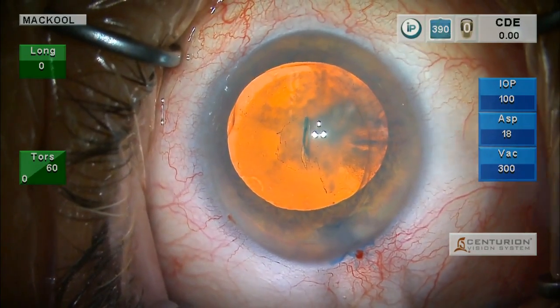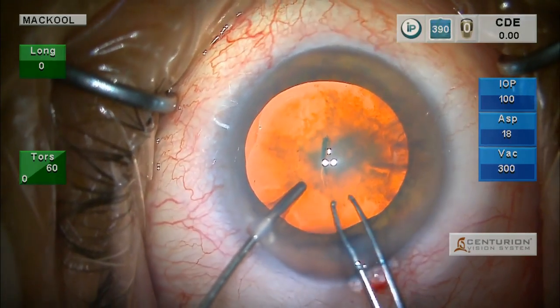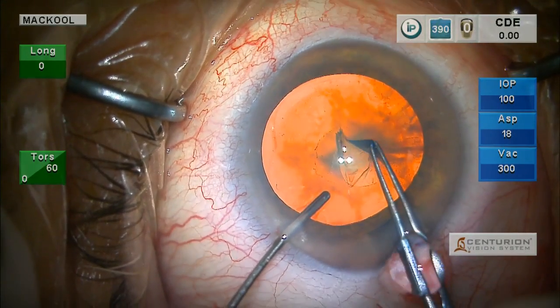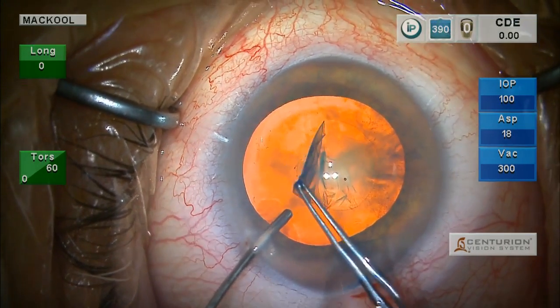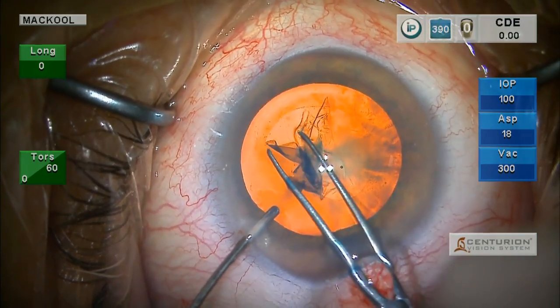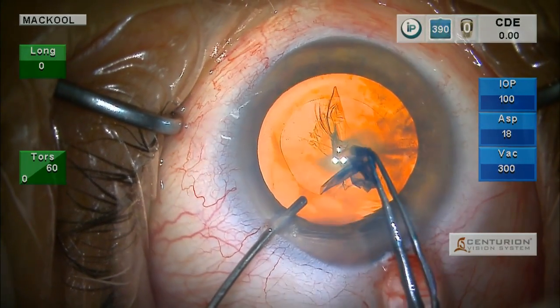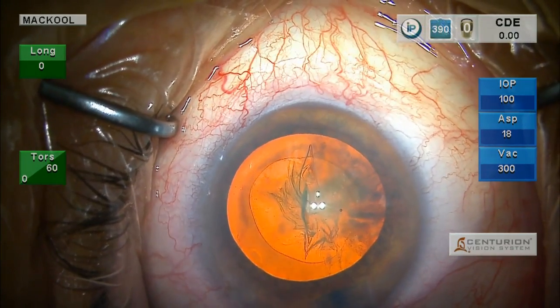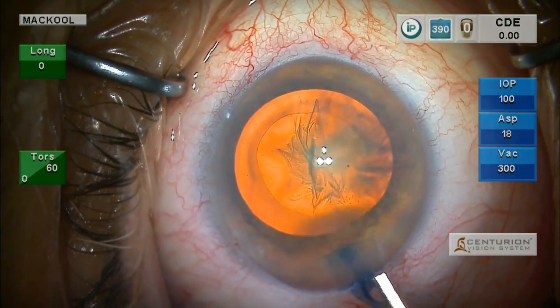Next, let's see what we think about the zonule during the rhexis. So far, I don't see any sign of significant zonular weakness. Now with a big lens and a stretched capsule, you may not see any even if there is a weak zonule. So it's nice to see no striae as you do the rhexis — it doesn't mean you're out of the woods.